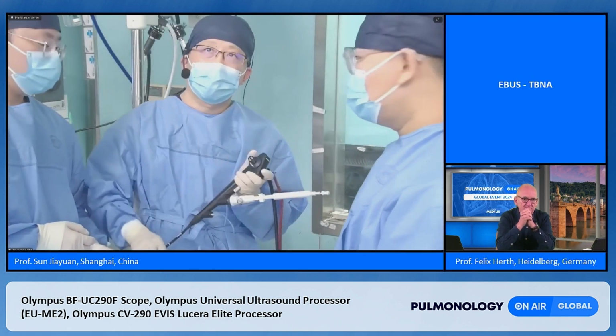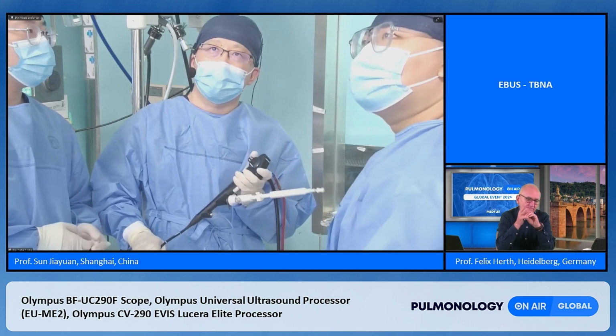We performed the second puncture of 11L.